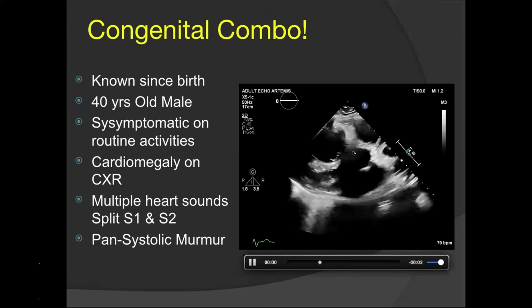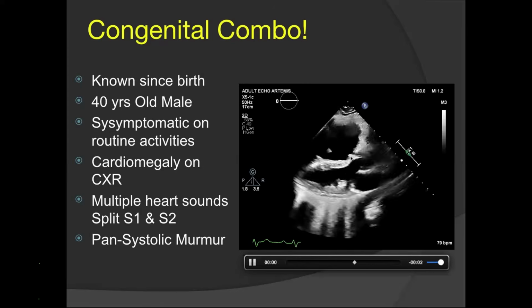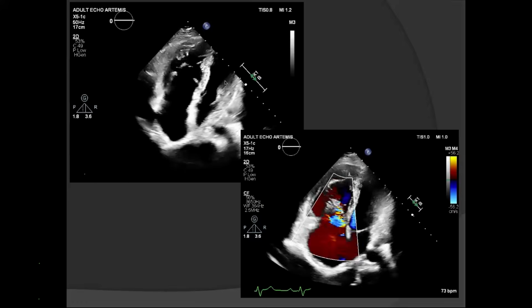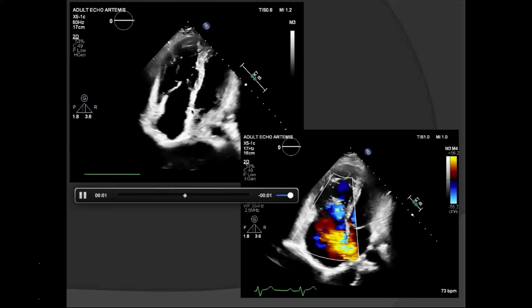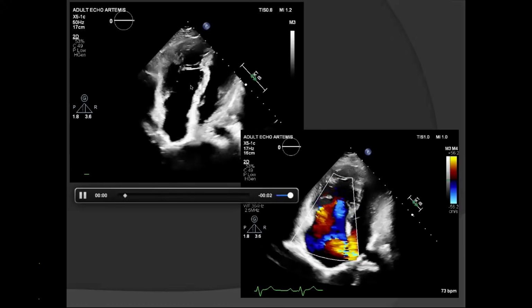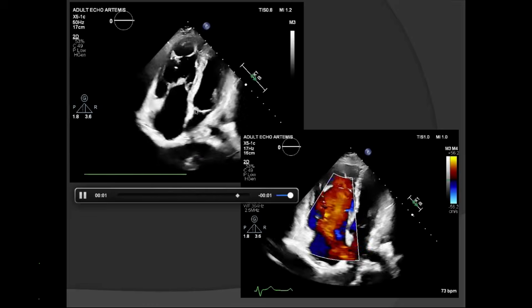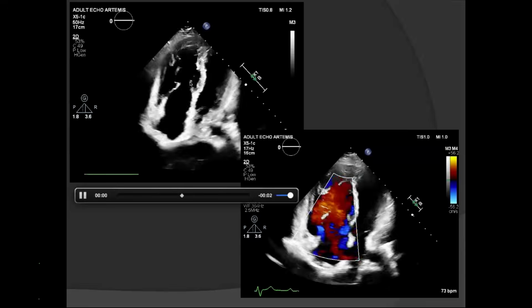But let us see in this again parasternal view, RVOT clearly dilated. We have RV dilatation on the cards. So we will evaluate this patient in more detail towards the right side. We will be focusing our eyesight towards the right side also. You can see in this 4-chamber view, the mitral leaflet and the tricuspid leaflet are inserted very differently. The tricuspid septal leaflet is more towards the apex as compared to the anterior mitral leaflet. There is distance between the septal insertion of the mitral leaflet and the tricuspid leaflet.